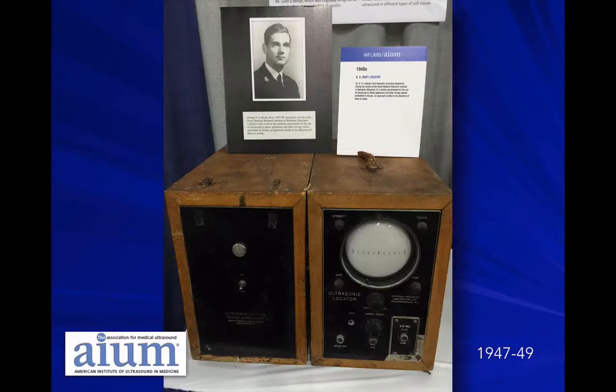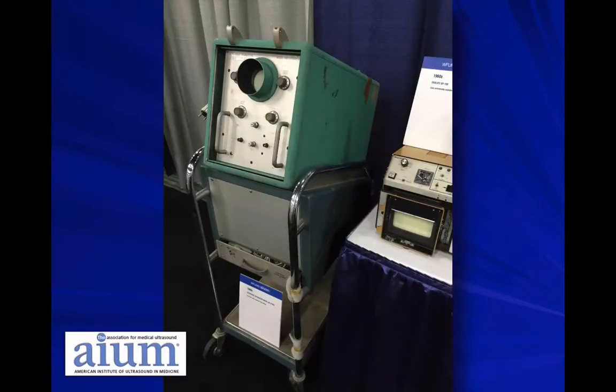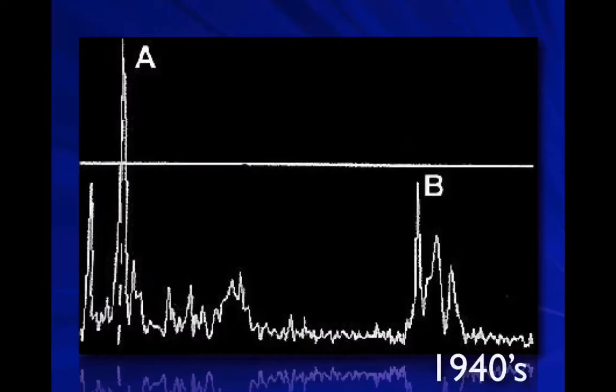And this is probably the first clinical ultrasound. It was used at a naval base in Maryland, I think, by Dr. Ludwig. In the 40s, the initial research was classified, but he was looking for gallstones and foreign bodies in tissue. And we have machines in the early days that look like that, pretty much like coming out of a car machine shop.